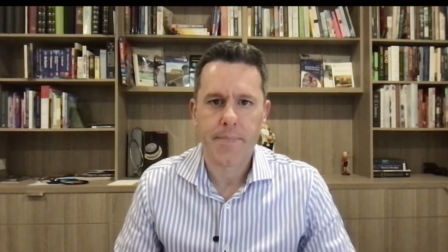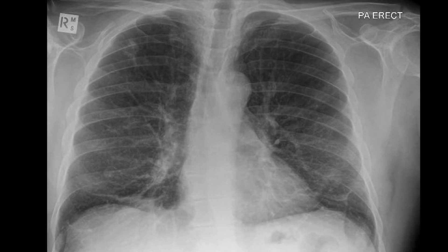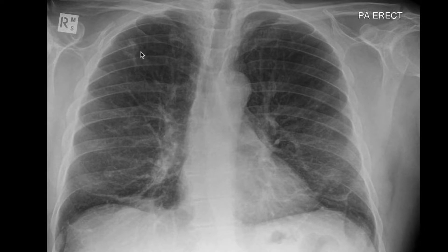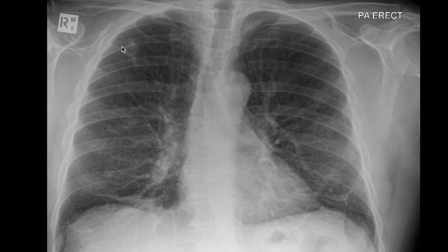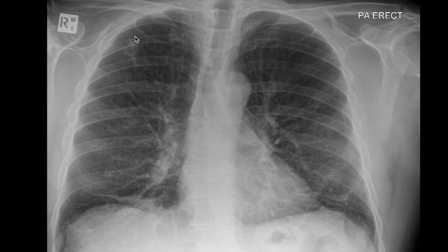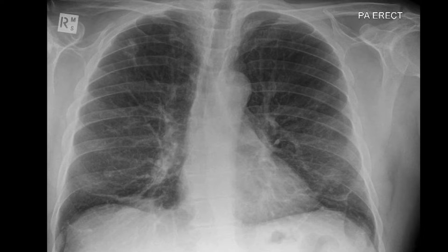A chest X-ray was performed which showed an abnormality. The chest X-ray shows there's an opacity in the right upper zone. It may even be forming a cavity and it measures about 18 millimetres.